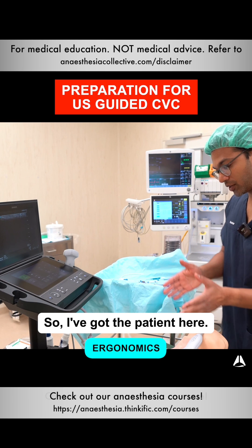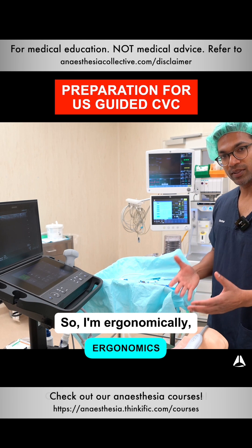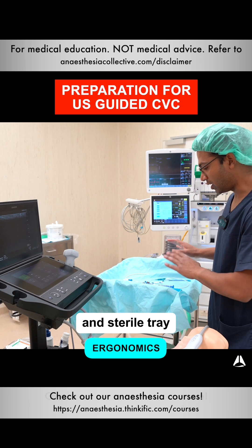I make sure I've got everything lined up. So I've got the patient here. The angle of insertion is going to be in this direction, so I'm ergonomically right. I've got my ultrasound there. I've got all of my kit and sterile tray over here.